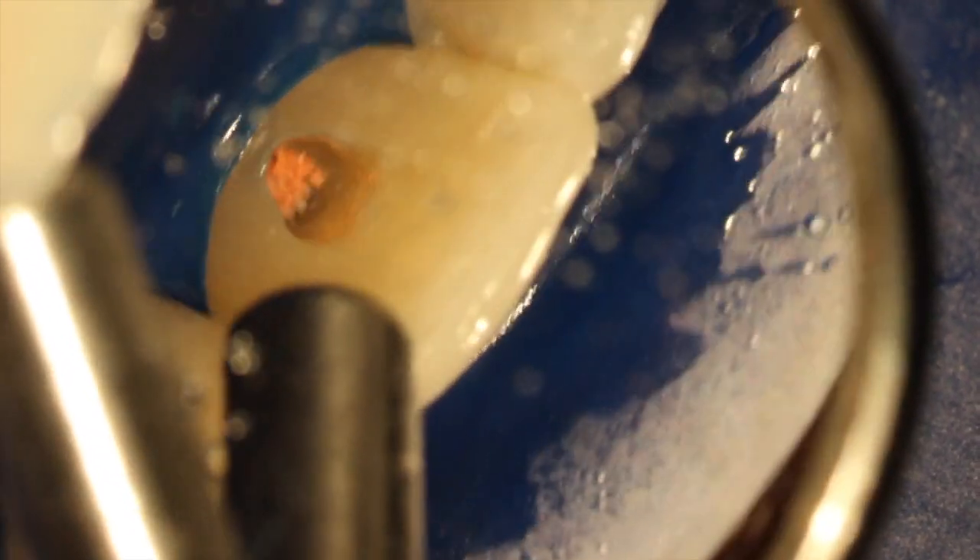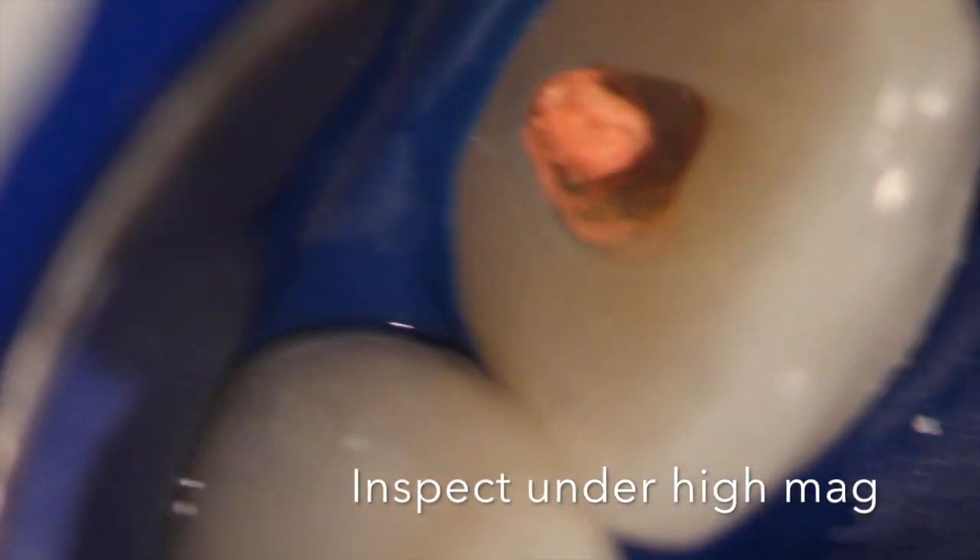So we re-accessed this tooth under the microscope. As seen in other videos, I like the 850 and 858 diamonds to open things up a bit and open the pulp horns conservatively. This was done using what's called the walking bleach technique. Back in the 80s, they used to put sodium perborate and superoxal paste, heat it up super hot and cook the tooth.